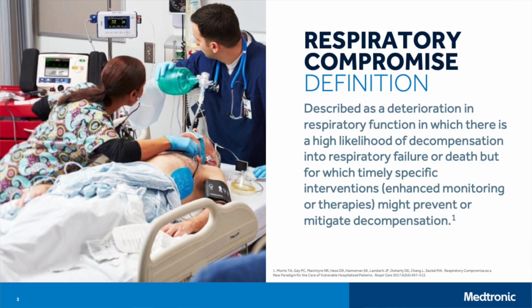Ultimately, capnography is not just a number, but the whole purpose of it is to try and monitor for respiratory compromised situations. What that means is we're monitoring ventilation. With capnography, the focus is respiratory rate and CO2. That's going to give us our ventilation status. We're using it in conjunction with pulse oximetry, which is giving us our oxygenation status.